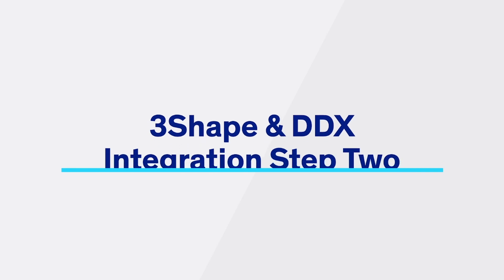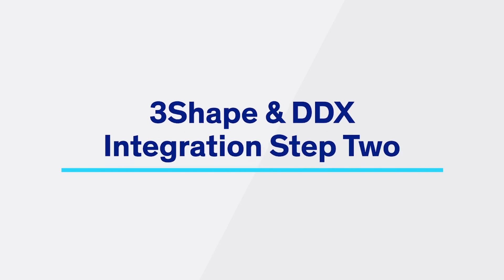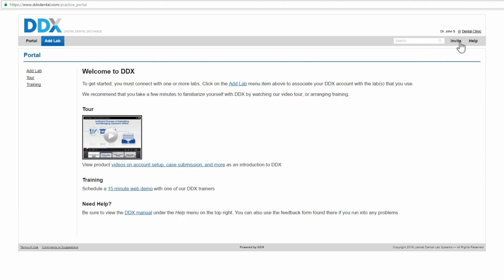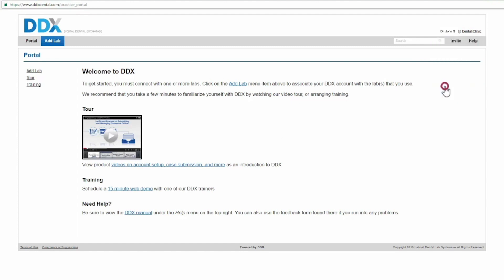Complete the integration by enabling it in DDX. Log in to DDX. Click on the name of your practice in the top right-hand side of the page. Select Store.